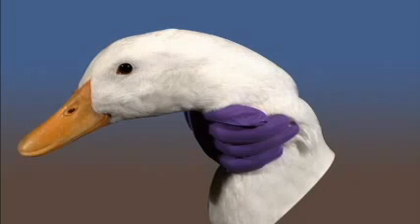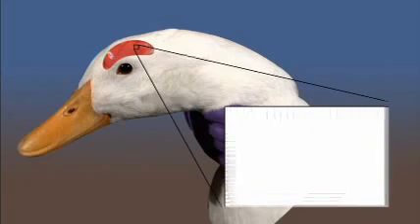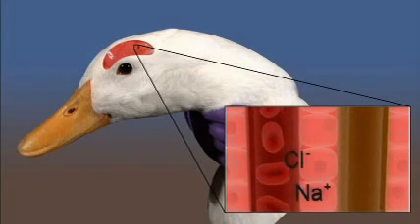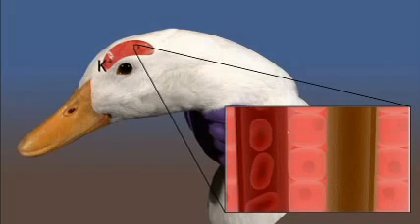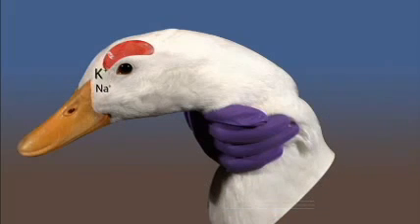One of the main anatomic differences between the duck and other poultry species is the presence of salt glands. The glands are located along the margin of the frontal bone, adjacent to the nasal concha. Salt glands are capable of secreting high concentrations of sodium, chloride, and potassium through slit-like openings into the nasal septum. The salt glands provide an extrarenal pathway for salt excretion, allowing ducks to drink hyperosmotic salt water.